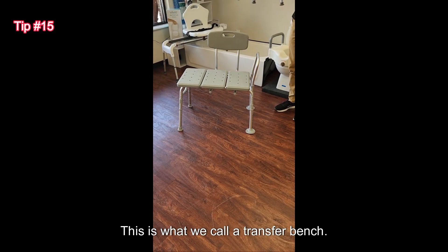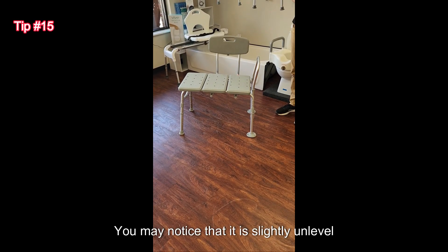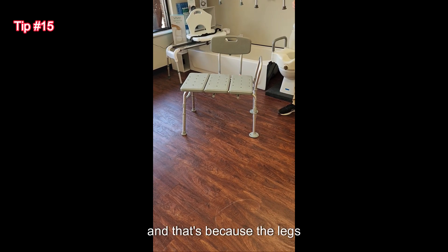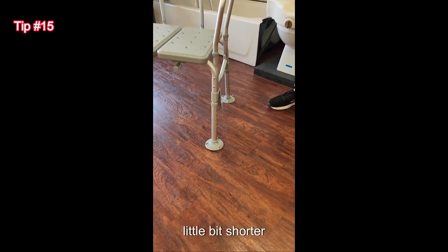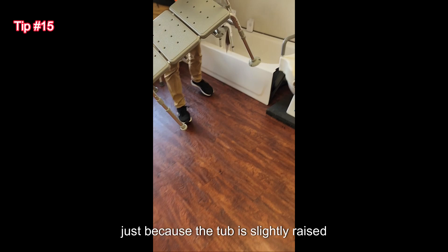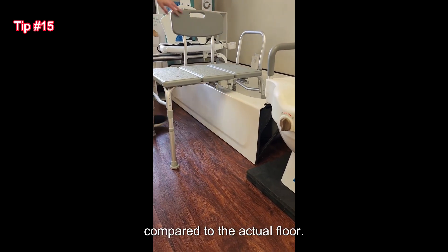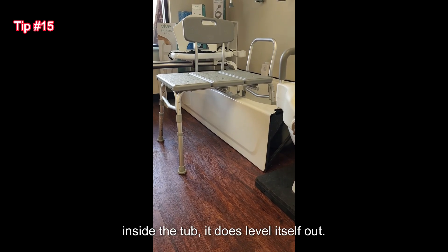This is what we call a transfer bench. You may notice that it is slightly unlevel or tilted, and that's because the legs that truly fit inside the tub need to be a little bit shorter just because the tub is slightly raised compared to the actual floor. So once we place that transfer bench inside the tub, it does level itself out.